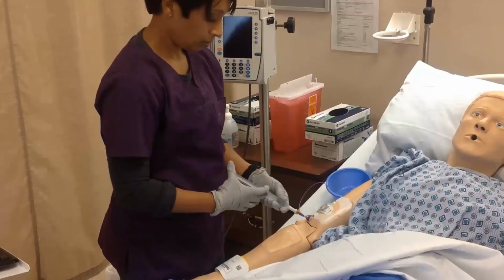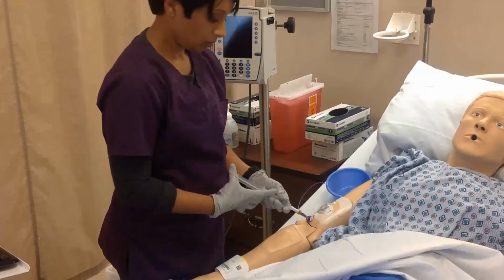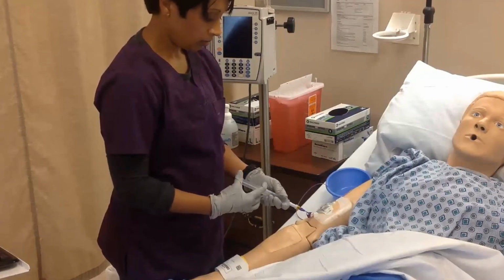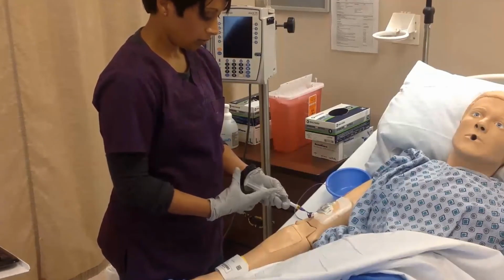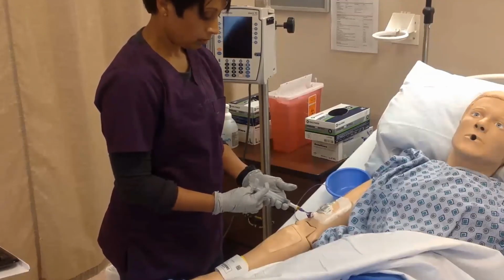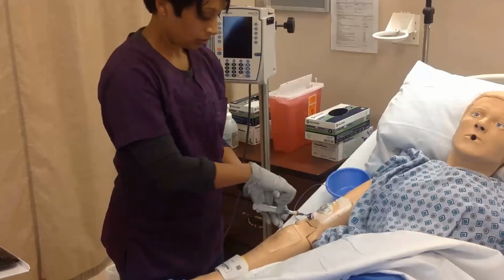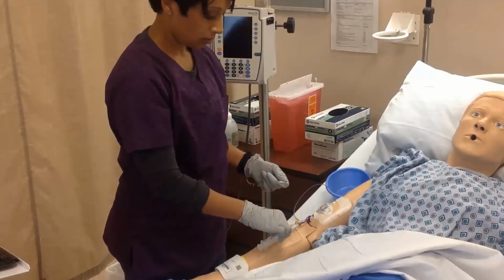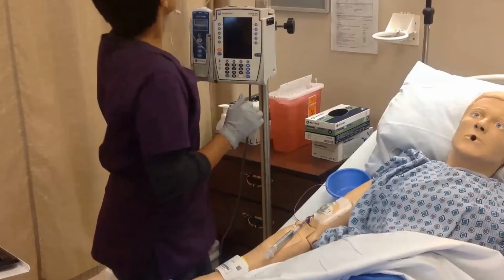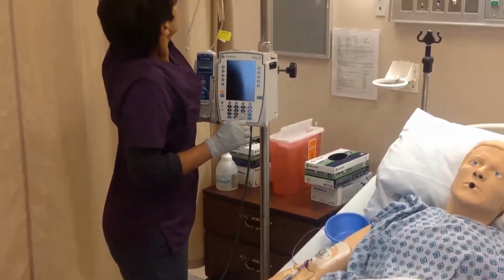Using the pulse pause method, flush the PICC line with 10 milliliters of normal saline. If you meet resistance, check the clamps. Because you are practicing with mannequins, please note to have a bowl next to the mannequin in order to collect the fluid for practice purposes. Leave the syringe in place and reach for the male luer end of the primary tubing.